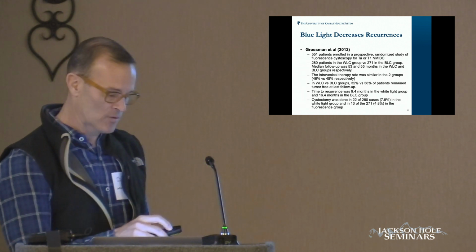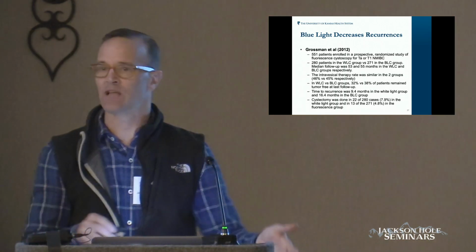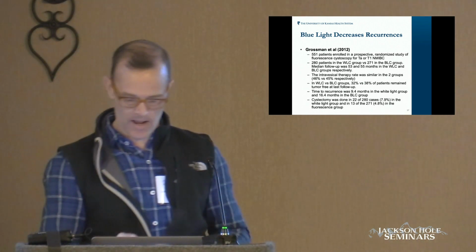I do want to point out this one point here from Bart Grossman's study. And again, I think this is a fascinating thing. In his study, they were able to demonstrate that they could decrease the number of patients that required cystectomy. Now, again, this is not really powered to show a significant difference here, but that's our main goal. Can I save someone's bladder? Can I decrease the need for cystectomy? And this study would suggest that you can.